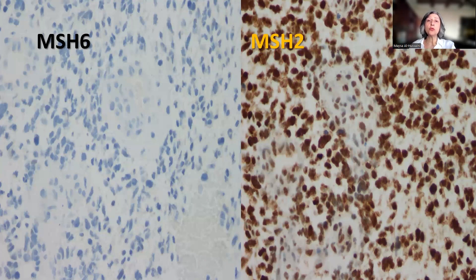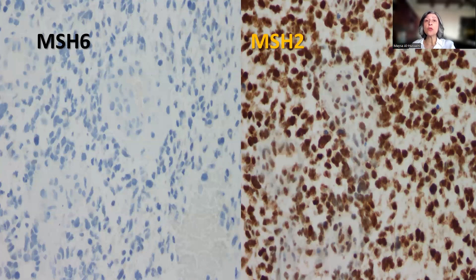It's very important to know how to read those immunohistochemical stains, because this is different from the way we read mismatch repair deficiency proteins in Lynch syndrome cases. In Lynch tumors, because we have a germline mutation in one allele and a somatic mutation in the other allele, we see loss of nuclear staining of any of the MMR proteins by immunohistochemistry in the presence of internal positive controls.